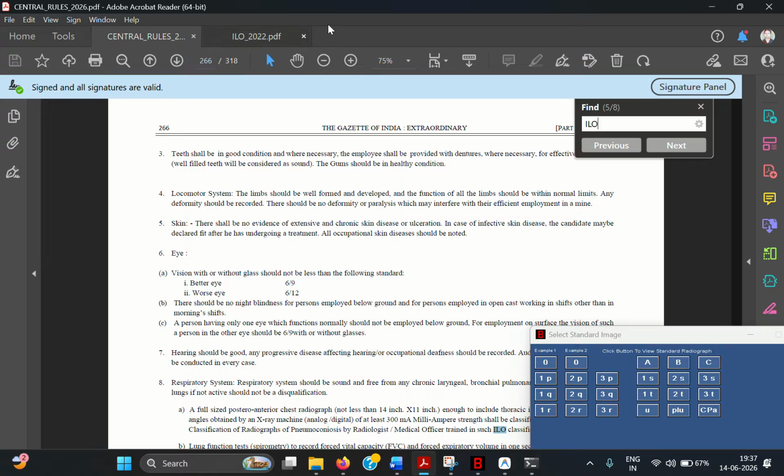So that's why it might be a very good solution for those who are doing this on a regular basis, and for that we are running the training program. It is a regular basis using the digital method along with the conventional method. But yes, as per the new guideline, the digital system is definitely the only way for the DICOM digital image.